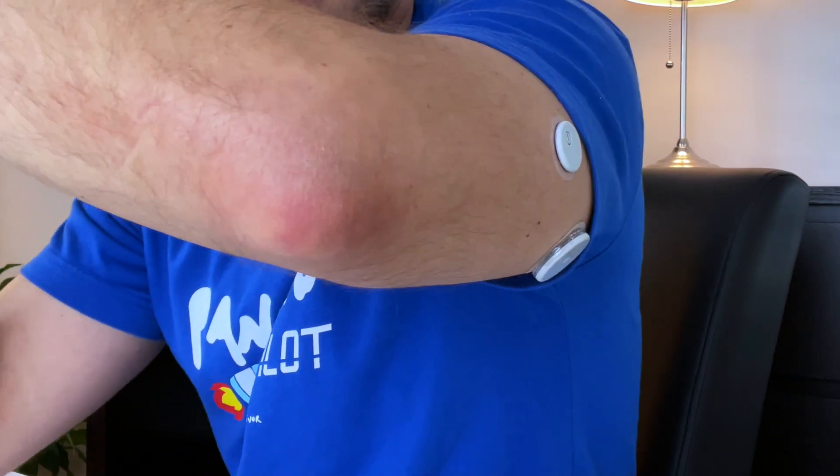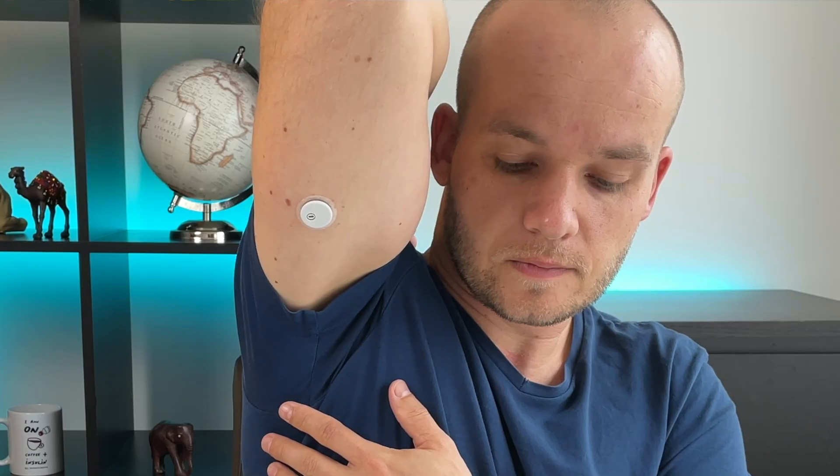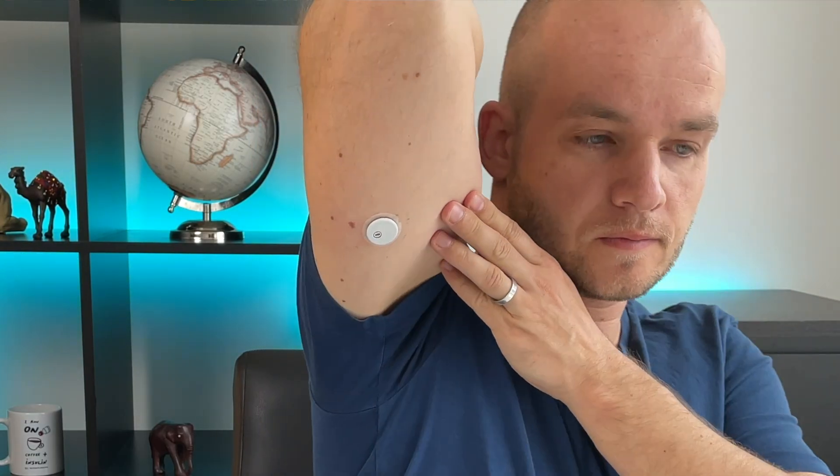The Libre 3 sensor is way smaller than the previous Libre generations, which makes it look really cool, but it also means the contact area for the sensor adhesive to stick to your skin is way smaller — making it quite easy to pull the sensor out by mistake. So if you do a lot of manual work with your arms or any contact sports, it might be worth considering an over-patch to protect the sensor.